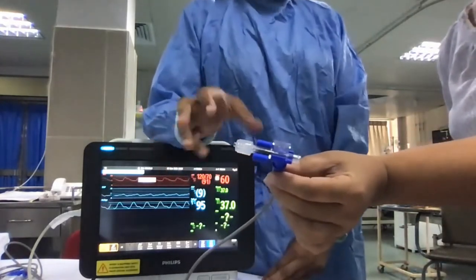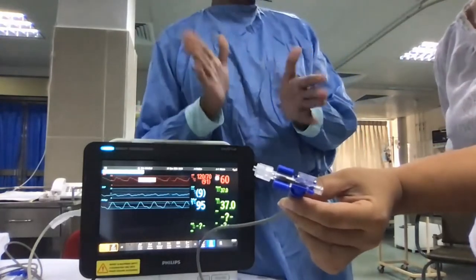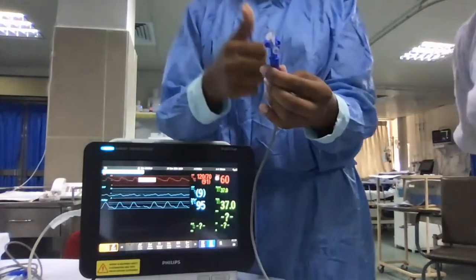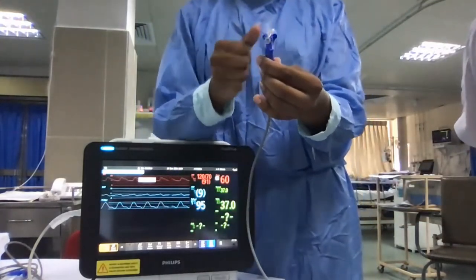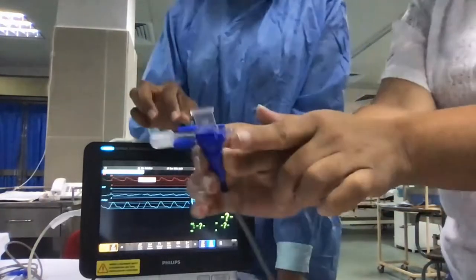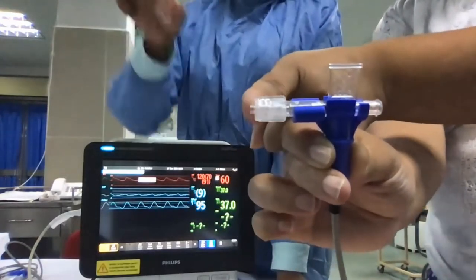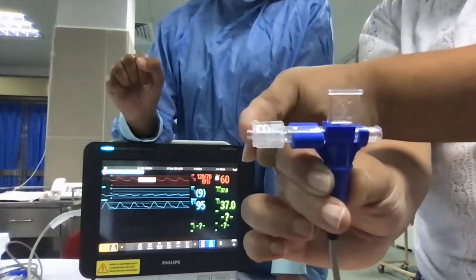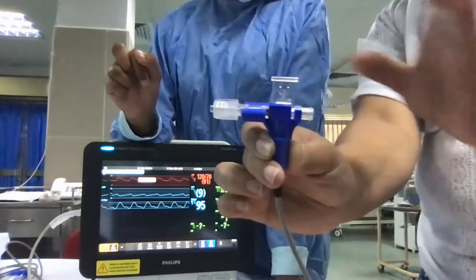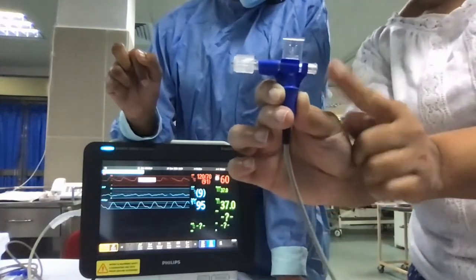For this procedure, madam, you need to have continuous CVP monitoring as well. So CVP cannot be interrupted in the middle. While monitoring CVP, we will be injecting our cold saline through this. So the 3-way tap goes here. This goes and directly connects to the brown port of the central line. Is it clear? Okay, so remember that, because otherwise if you jumble, you will be in trouble. So the 3-way tap should come onto this side.